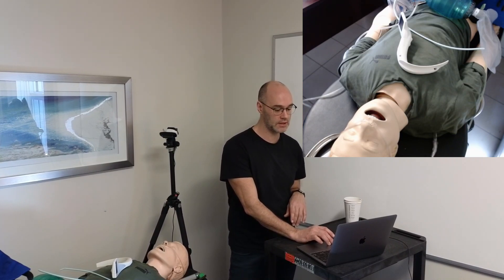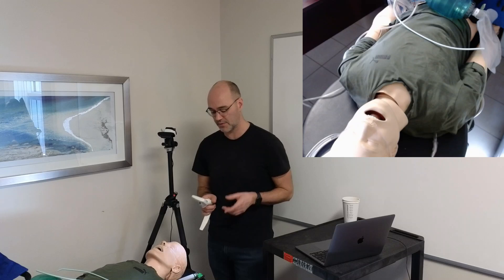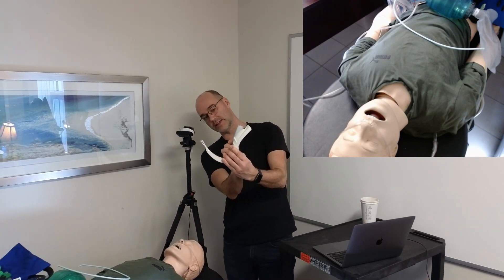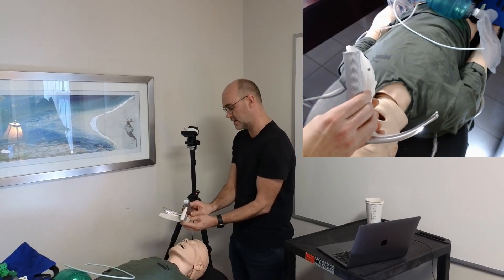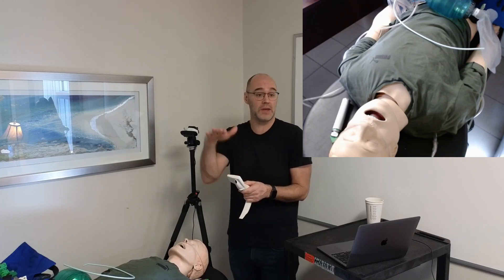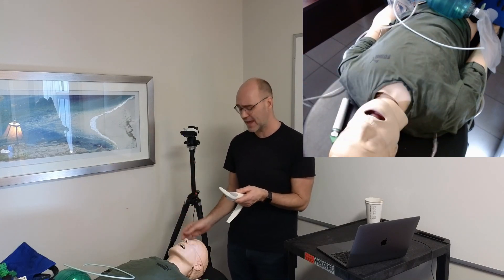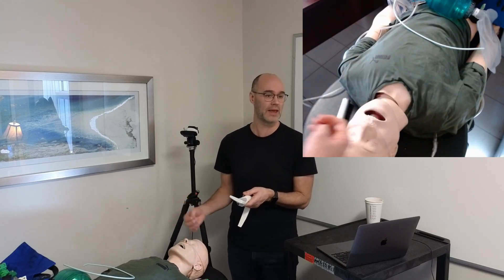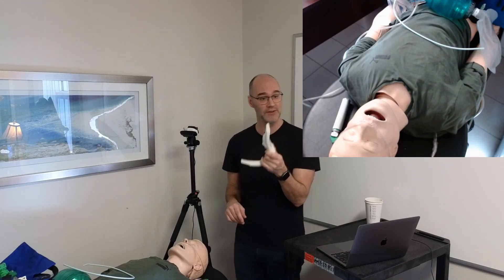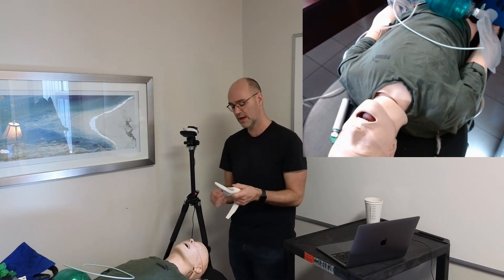Now let's talk about direct laryngoscopy. I'm going to use this video laryngoscope — it has a Macintosh-shaped blade with no hyper-acute angle, essentially exactly the same shape as a direct laryngoscope blade. Video laryngoscopy has changed practice. Your first attempt in most patients should be a video laryngoscope; exceptions would be patients with lots of blood in their airway that might obscure the camera. It used to be very expensive, but now it's a hundred-dollar disposable device, so there's no reason not to have one available everywhere patients are intubated.